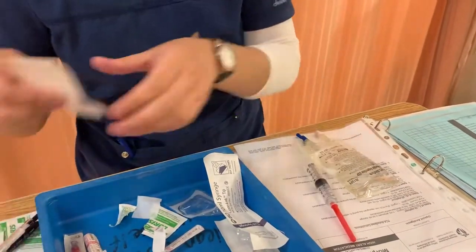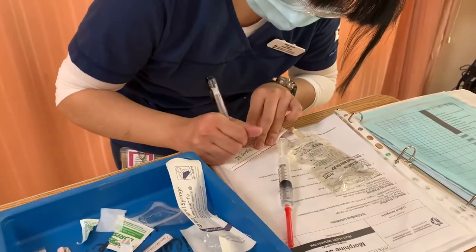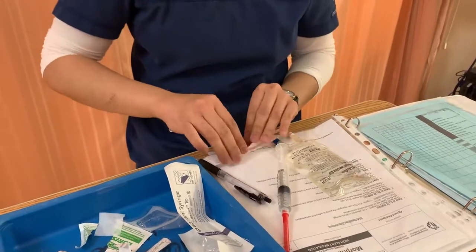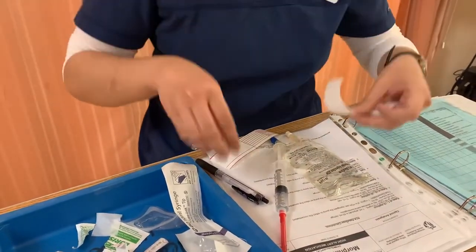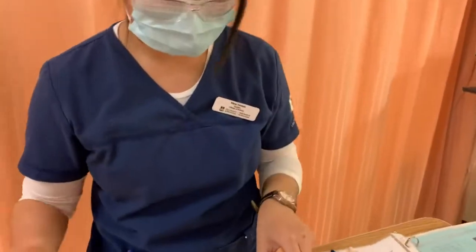I'm just gonna label this as the excess normal saline. And that is the 5 mLs, so that I don't confuse it with anything else. Just gonna put that in there. There we go. I'm gonna put that aside for now so we can check it later.